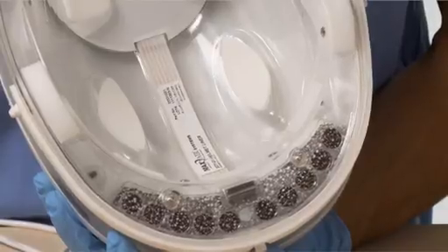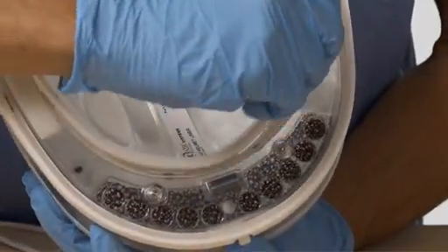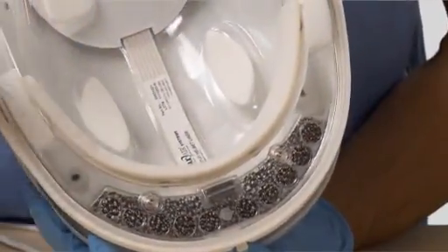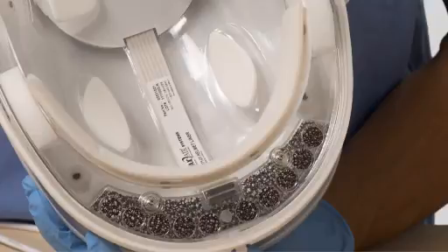Attach a new comfort strip onto the front of the helmet by attaching the new strip to the front headband and centering it on the headband Velcro strip. Note that only one side of the comfort strip will attach to the headband.